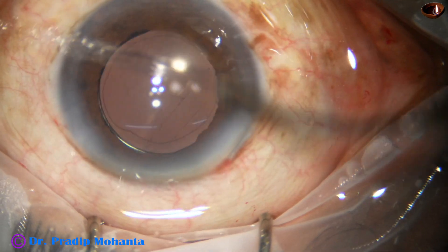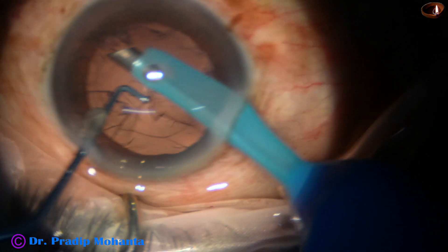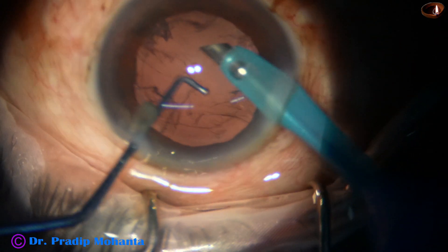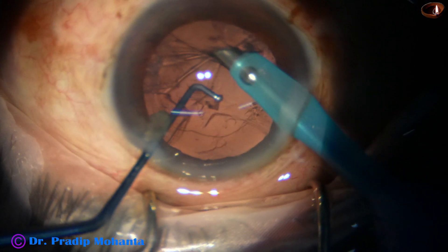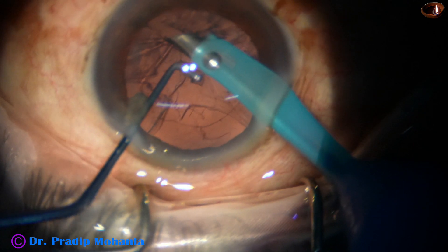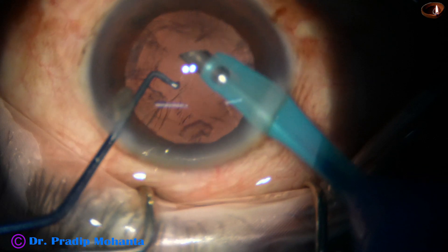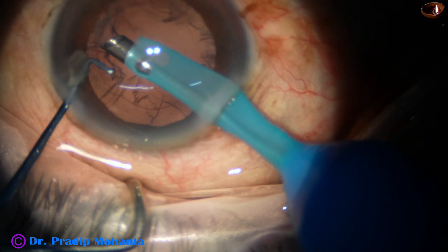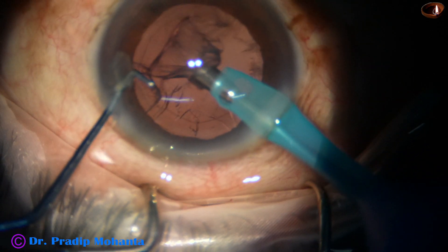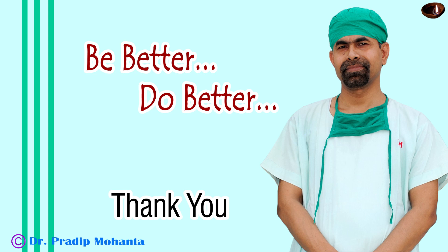Closure of the side port, then the anterior chamber is formed nicely and the case is concluded. Let us see this part in slow motion. Here I try to remove some cortex, and here I catch the posterior capsule. I use reflux — I stop first and then use reflux — and I could release the posterior capsule. All of us must train our foot to be able to do this.